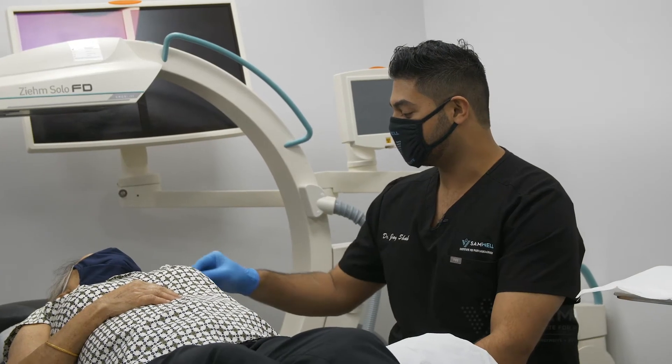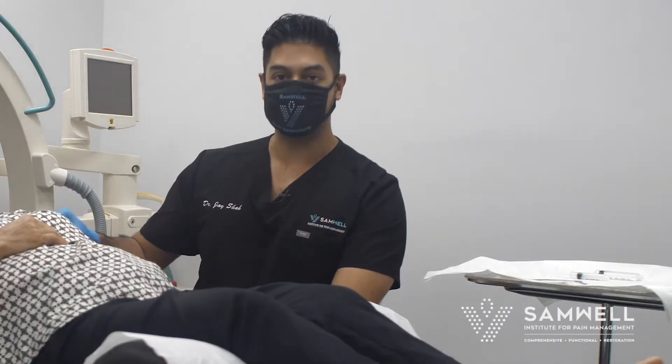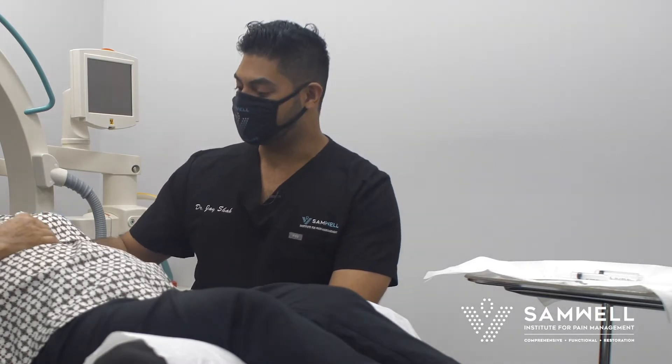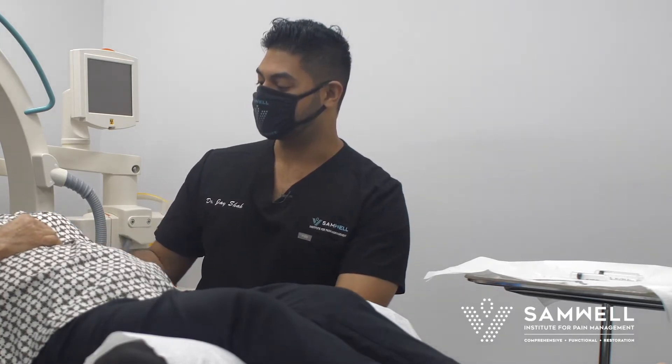What we're doing today for our patient is a subacromial bursa anti-inflammatory steroid injection under direct needle visualization via ultrasound guidance. This is typically done for patients who have rotator cuff tendinopathy or tendinosis and they get some bursitis.